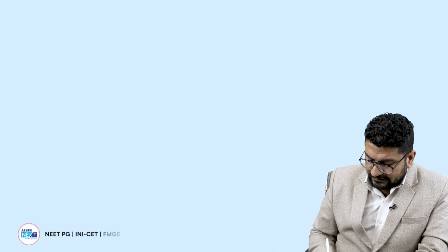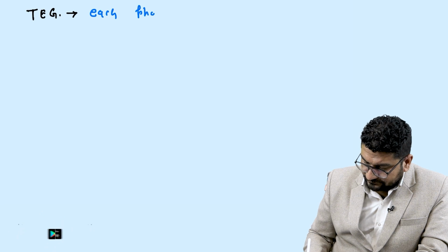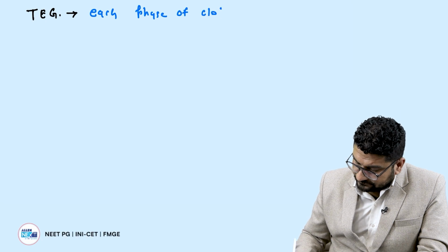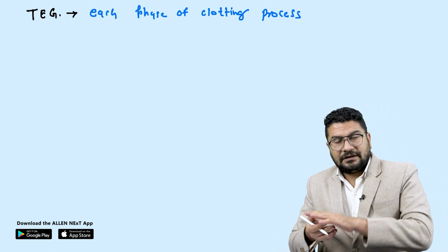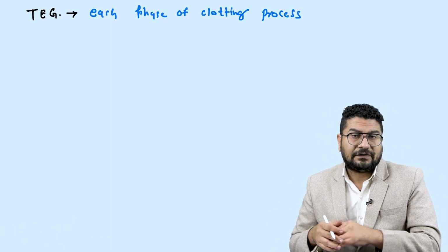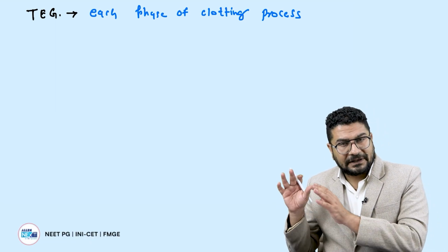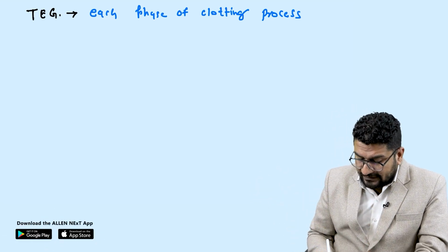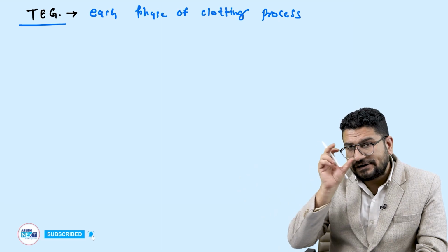The benefit of doing a thromboelastogram, TEG in short, is that from this we can check each phase of our clotting process. For example, we have PT and INR for the extrinsic pathway, APTT for the intrinsic pathway, then BT and CT. But they are specific to a particular fragment of the clotting cascade or platelets. With the thromboelastogram, you can check each phase, from aggregation to fibrinolysis.